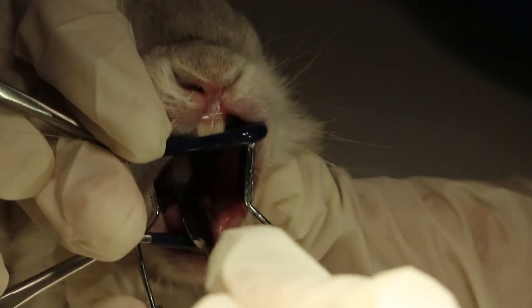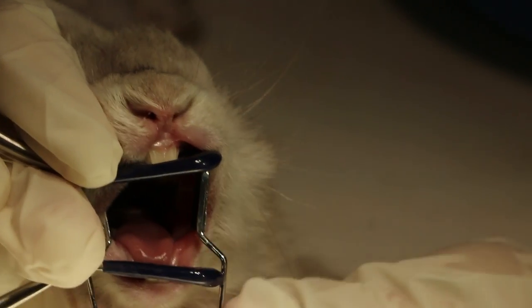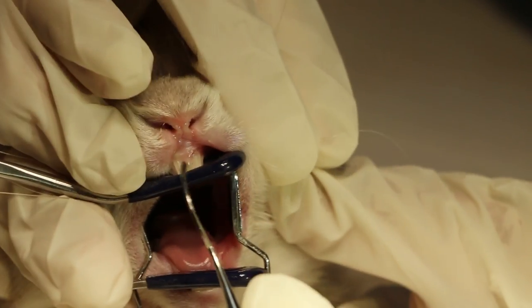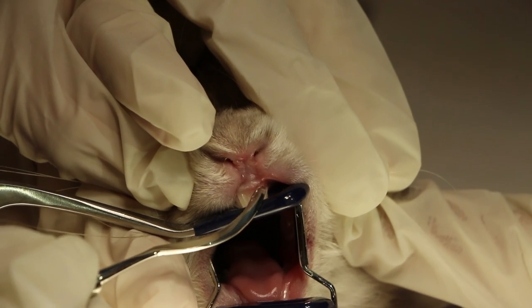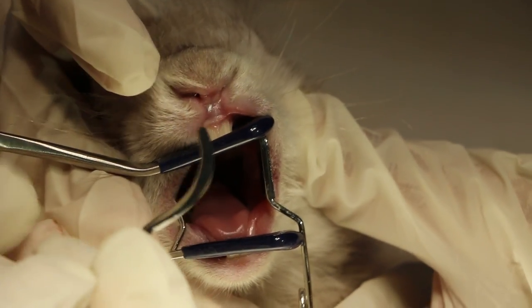This is the demonstration on the rabbit — there's nothing to be done here. We are just demonstrating the luxator. That's how you loosen the ligament between the tooth and the gums for those decayed teeth. This is just a demonstration.